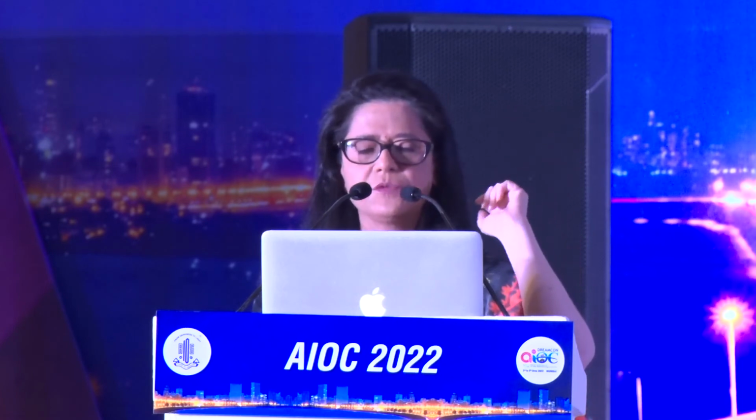So, how to choose the lens when you go back to your OPDs: please make a questionnaire format. There are some standard ones out there. Even the company people give you these, and the patient sitting in your OPD while being worked up can fill in those forms as to what his visual requirements are. I'm not going to go into detail here because after the end of the instruction course, we will discuss what the patient's requirement is. For example, if somebody's near work is more or distance is more, we will decide different clinical situations and help you choose a lens.